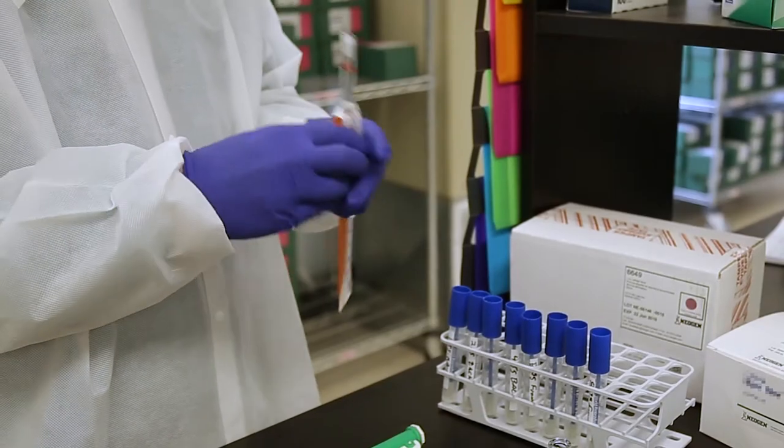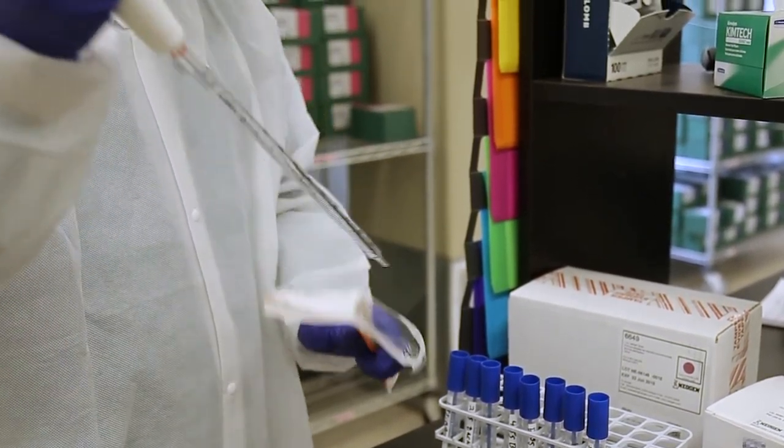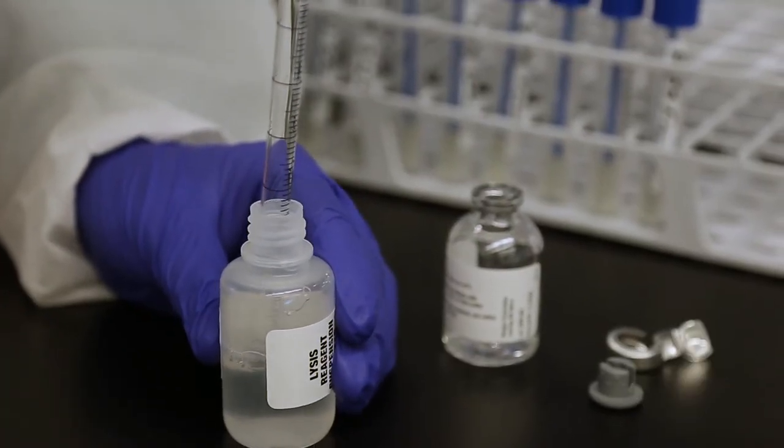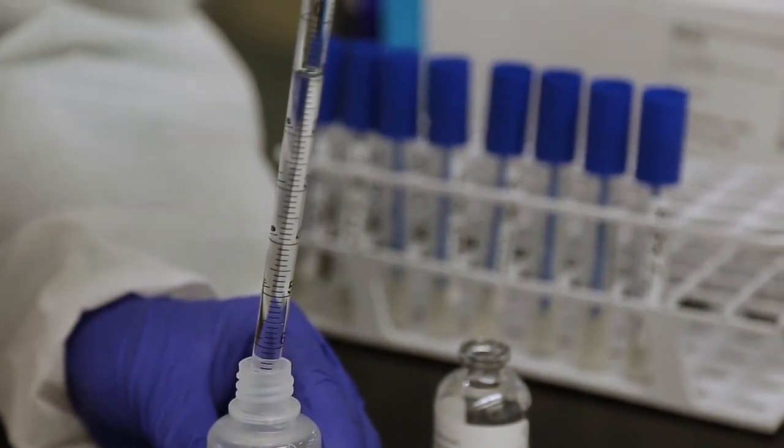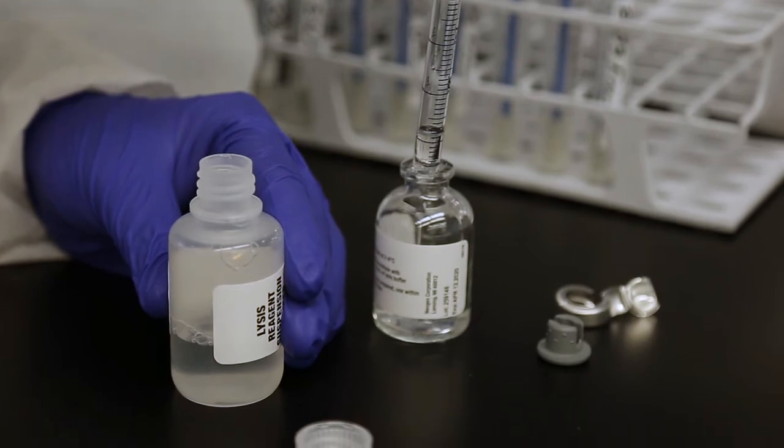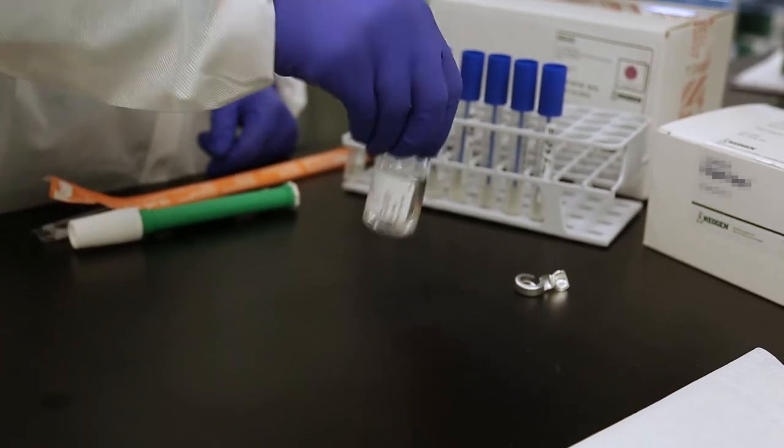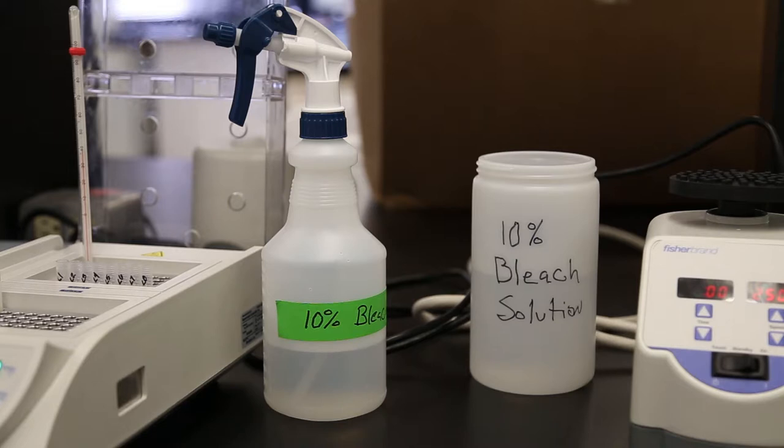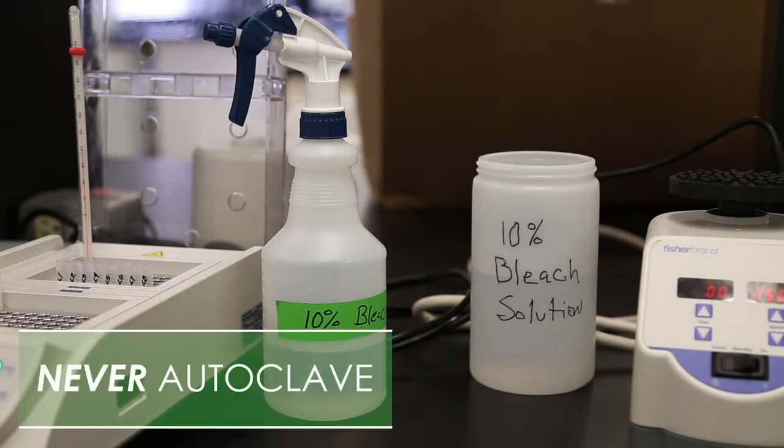Reagent preparation. Using the 10 milliliter serological pipette and provided pipetter, add 18 milliliters of the lysis reagent to one vial of the lyophilized lysis reagent that's been at room temperature for at least 15 minutes but less than one hour. Gently swirl to mix. This is enough lysis buffer for 18 samples. Return the non-reconstituted reagents to refrigeration. Any reconstituted reagents can be stored at 2 to 8 degrees Celsius for up to 30 days. Mix up a fresh container of 10% bleach solution daily. The pipette tips and used reaction tubes and caps will go into this solution.